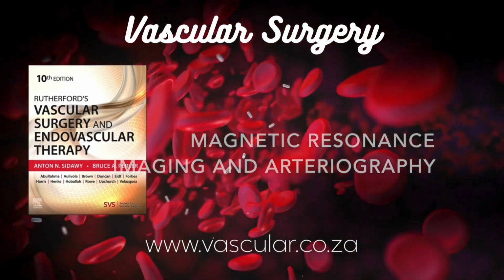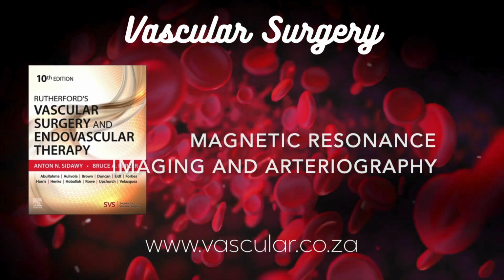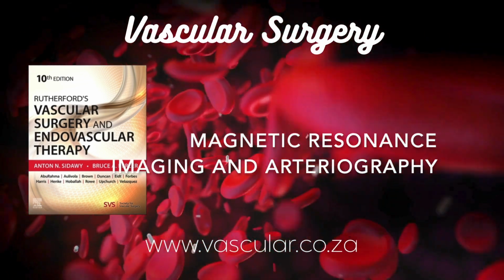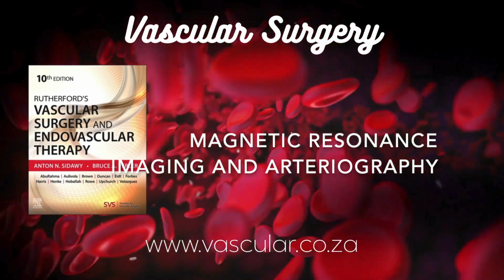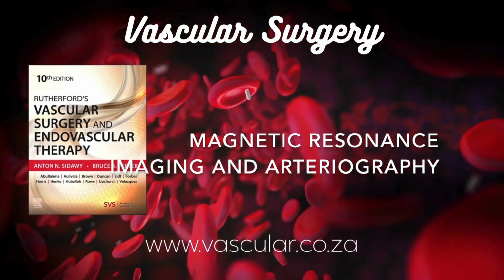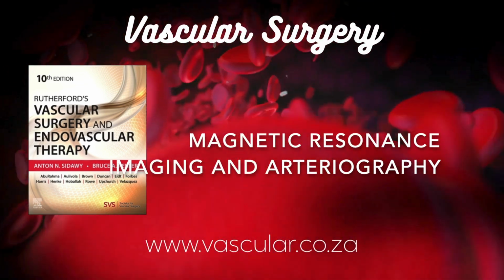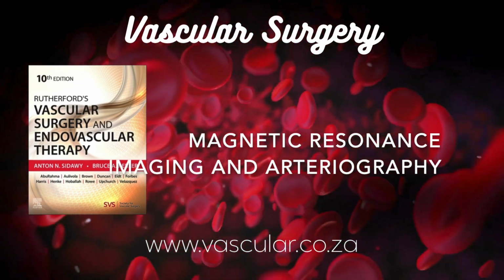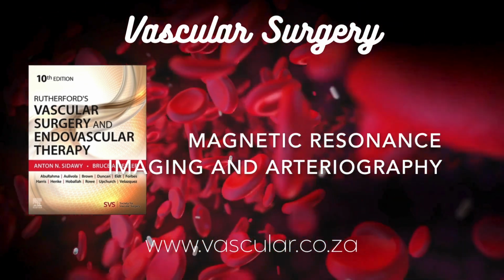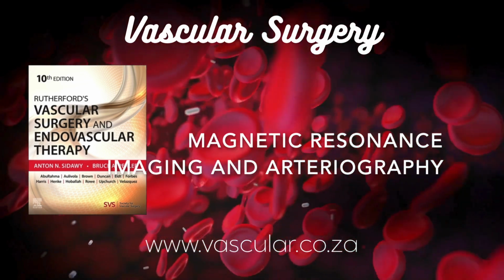But you sacrifice resolution. Traditionally, yes, there was a trade-off between temporal resolution, speed, and spatial resolution, detail. But techniques are constantly improving to get better detail faster. Very useful for understanding flow dynamics. What about new contrast agents? Yeah, that's a big area. The standard GBCAs we use distribute pretty quickly out of the blood vessels into the surrounding tissues. Okay. So the time window for perfect arterial imaging can be short.